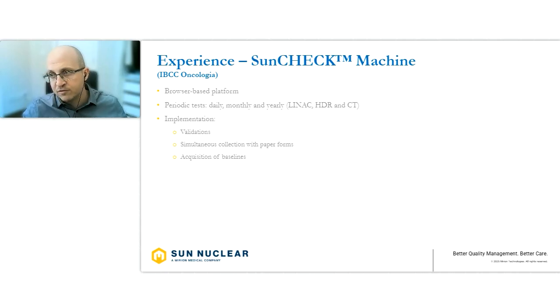So we have all of the machines controlled by the software. In our implementation phase we validated the platform, because it's software and we need to be careful about the results.